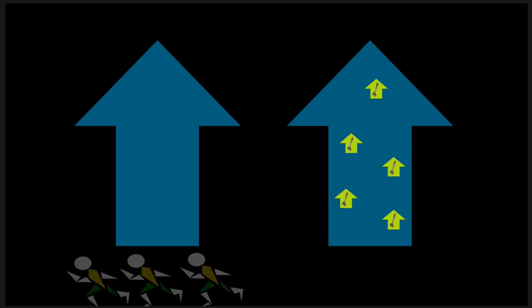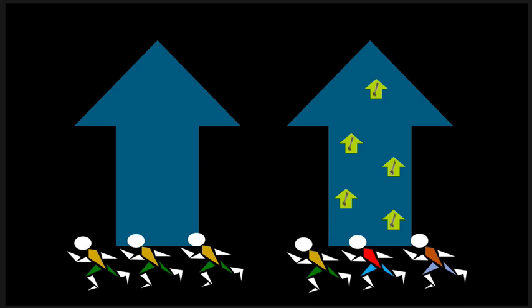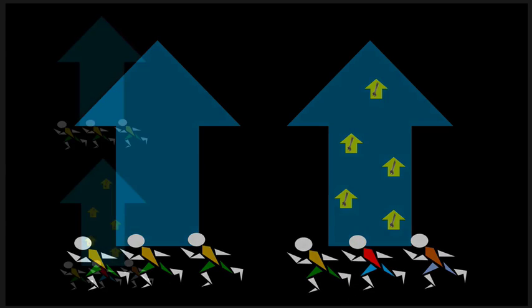It doesn't have any local tissue that's creating susceptibility, versus the other one that has speckles of tissue that are capable of being magnetized and then either opposing or augmenting the magnetic field, in this case augmenting it. So where these guys were homogeneous, this is heterogeneous, right?